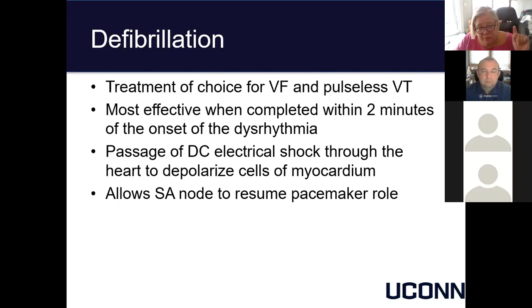But before you push that defibrillate button, you always say clear off the bed. You look to make sure no one is leaning on the bed. Again, it's a great way to shock whoever is still leaning on the bed. So you need to take that time to make sure it's safe.